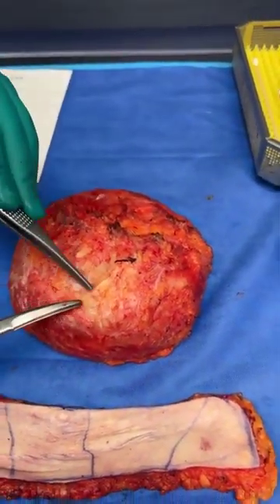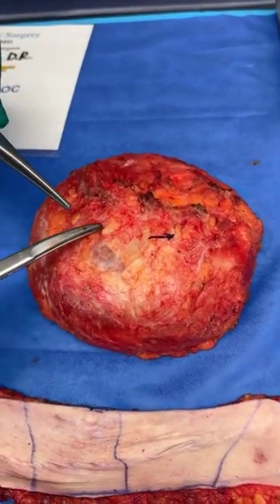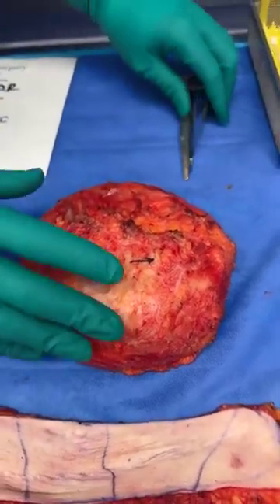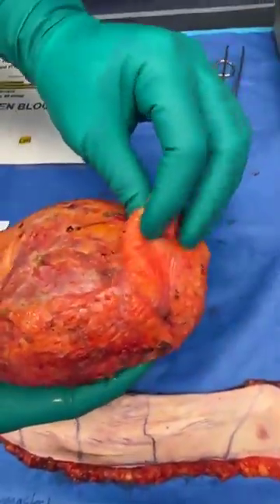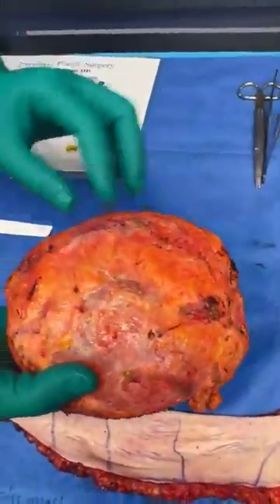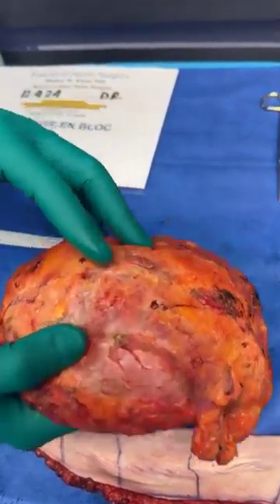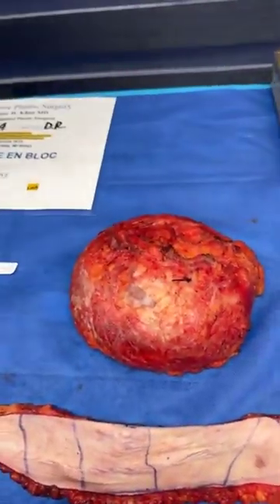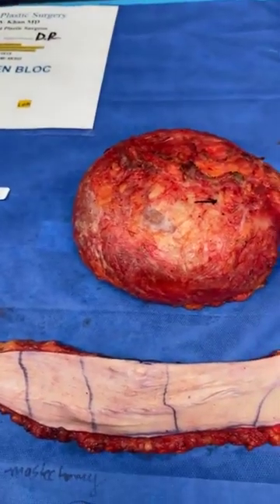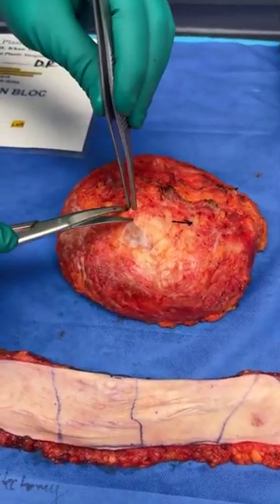And again, you can actually see the boundary of the AlloDerm right here. Now, if I flip this around, you will see this is excess tissue, very hard, inflamed. And this was underneath the muscle, and overall I'm very happy and content. So just a 10-year-old set of implants. This is the better, nicer gummy bear, the cohesive implant. I'm going to go right at the boundary.